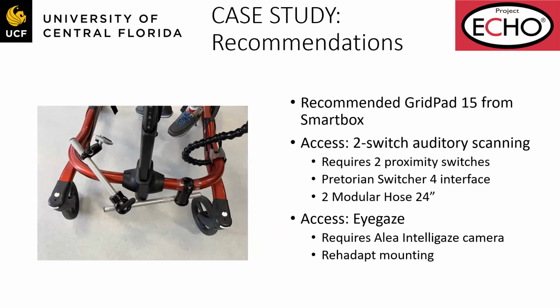Another reason that the GridPad was selected over continuing with the Tobii Dynavox was that we were also thinking about what he might be doing for computer access as an adult.